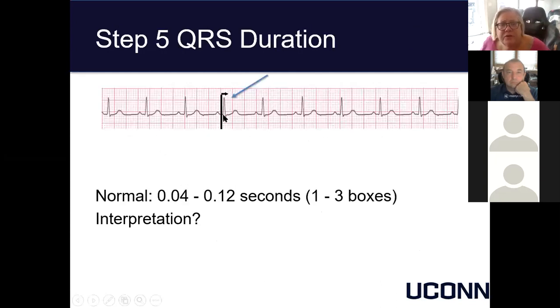And again, you need to measure the QRS duration from the beginning to the end. It should be less than 0.12 seconds.